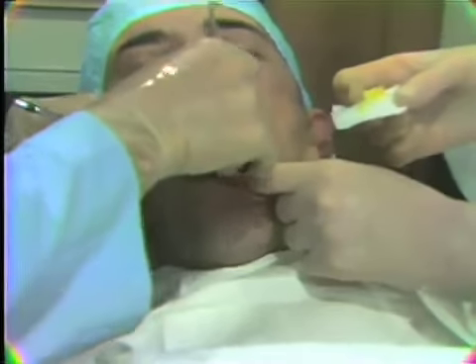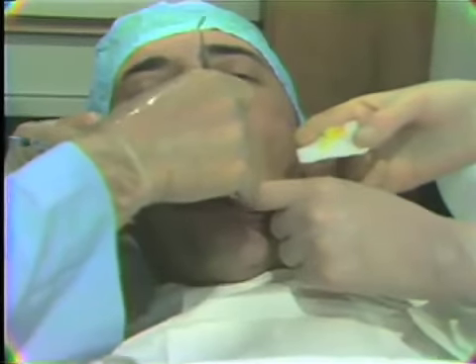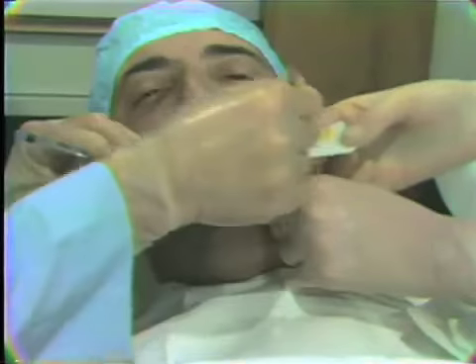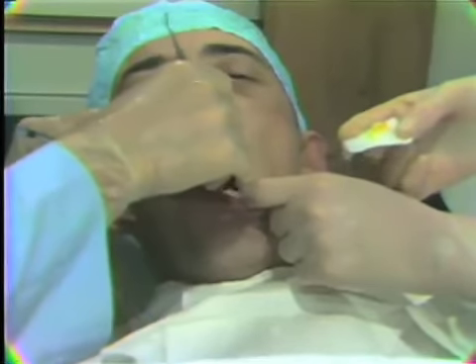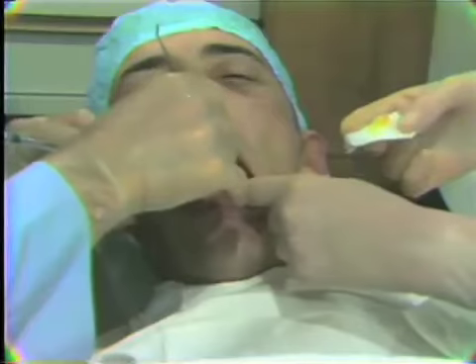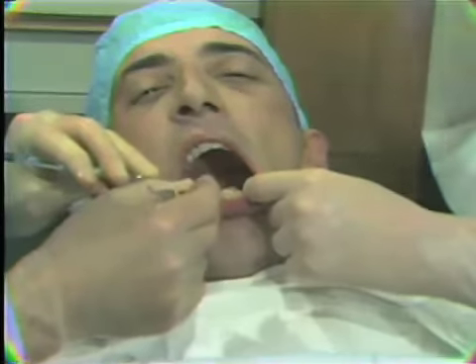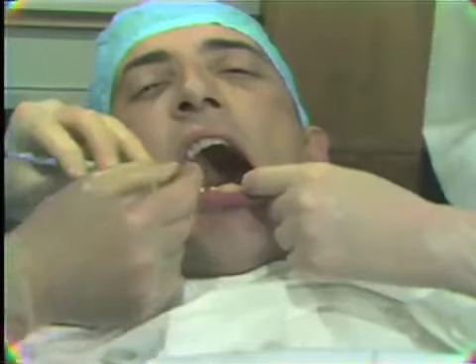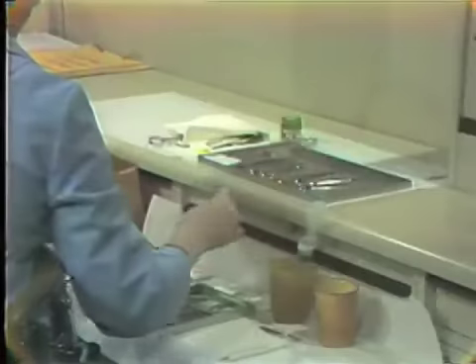The acromycin ointment, as you see, can be placed in the labial portion of the surgical site as well as the lingual portion, trying to manipulate the instrument so that the interproximal areas, the entire surgical site then is covered with the ointment. Now we can move to preparation of the periodontal dressing and placement of the periodontal dressing.